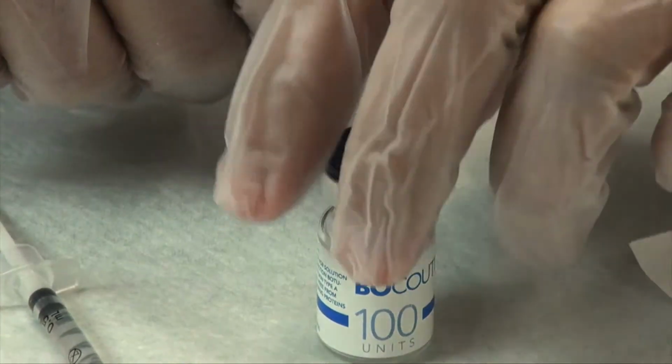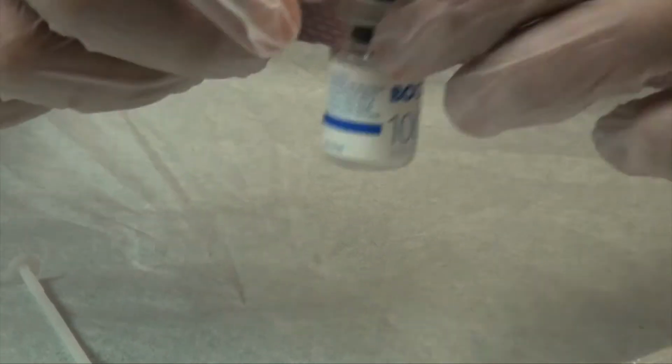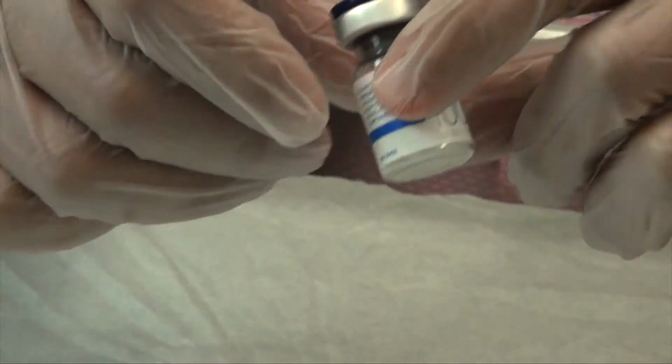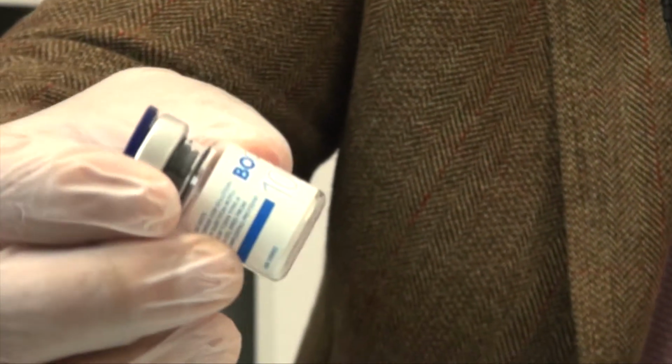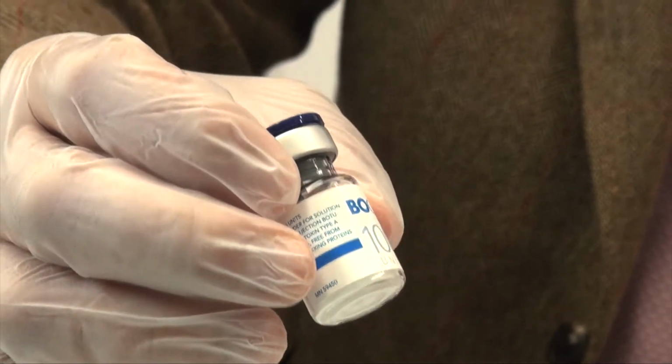The powder in the Bocouture vial is actually much more visible due to the way that it has been packaged. So here you can have what looks like a nugget of white powder versus the Allergan vial, which was just a fine ring of white powder at the base.